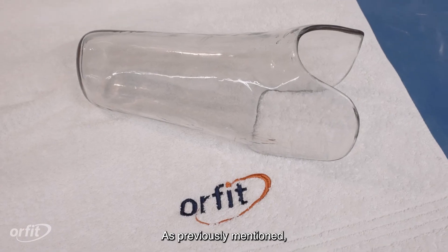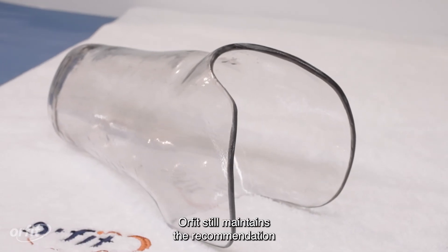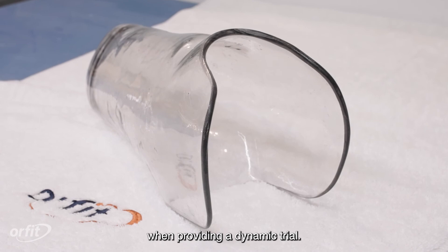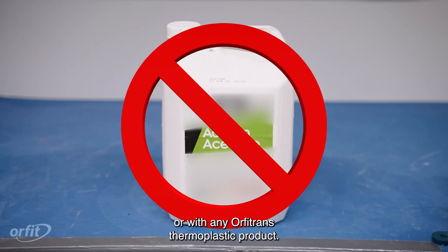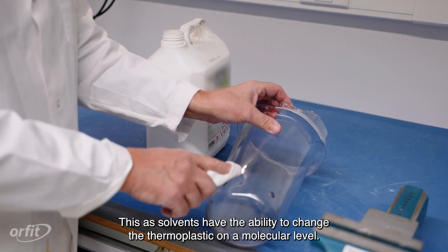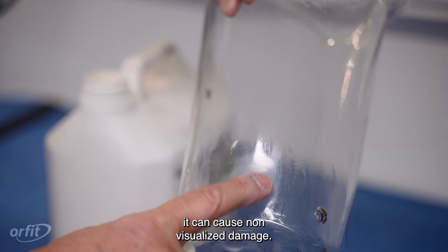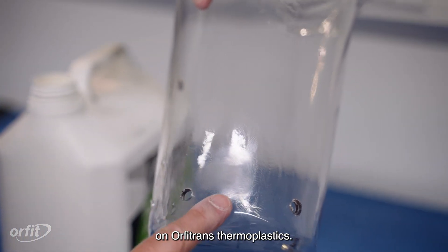As previously mentioned, Orphatrans PETG is designed to be used for short-term supervised test fittings. Orphat still maintains the recommendation that clinicians should use a synthetic cast wrap to reinforce the test socket's connection to components when providing a dynamic trial. Solvents should not be used with Orphatrans PETG or with any Orphatrans thermoplastic product, as solvents have the ability to change the thermoplastic on a molecular level. Even if the solvent does not appear to be damaging the thermoplastic, it can cause non-visualized damage. Therefore, it is recommended to avoid use of any solvents on Orphatrans thermoplastics.